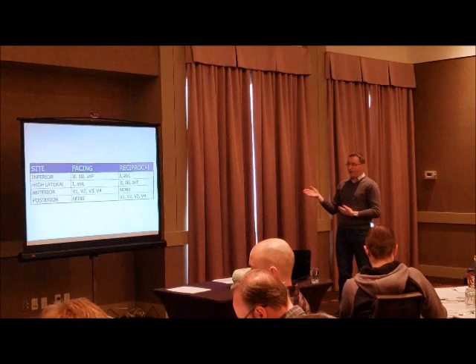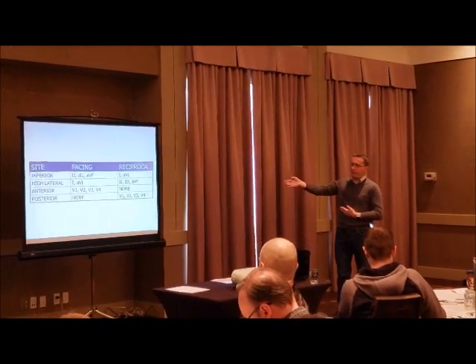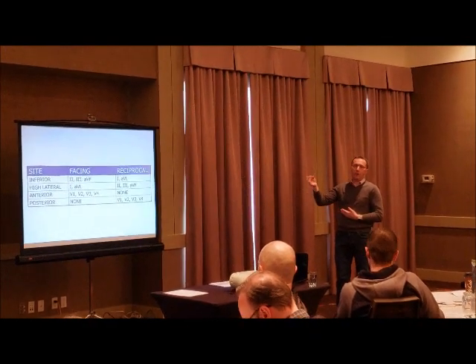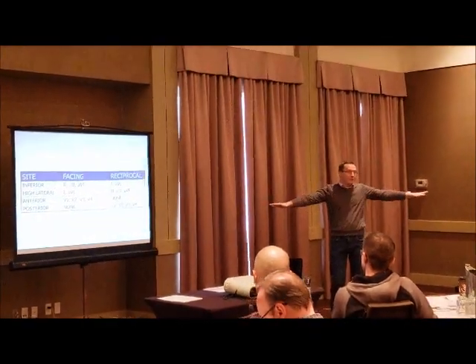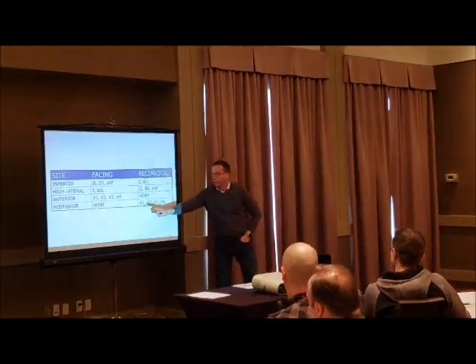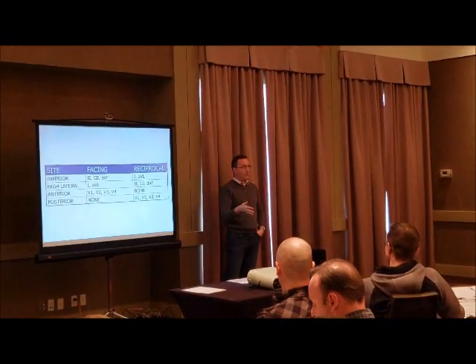Versus an isolated anterior infarct, you may have no reciprocal changes, which can pose some challenges, or the posterior infarct, a true isolated posterior STEMI, no ST elevation on the ECG at all, but we derive that they're having an infarct from the reciprocal changes in leads V1 through V4, okay?